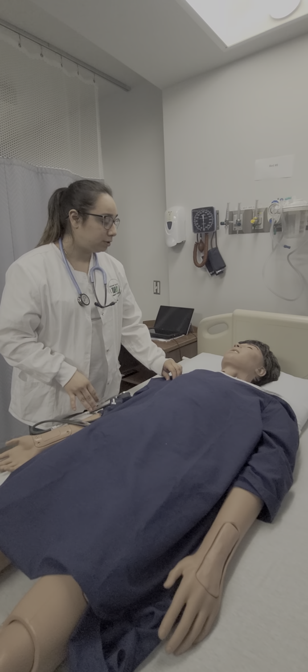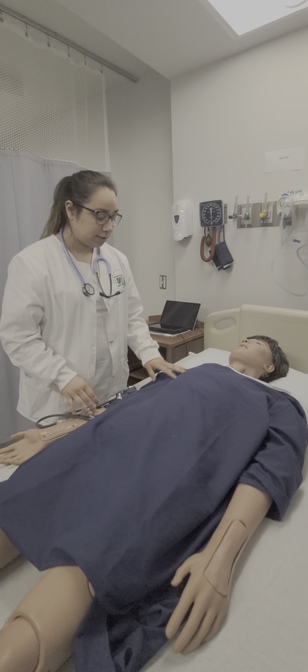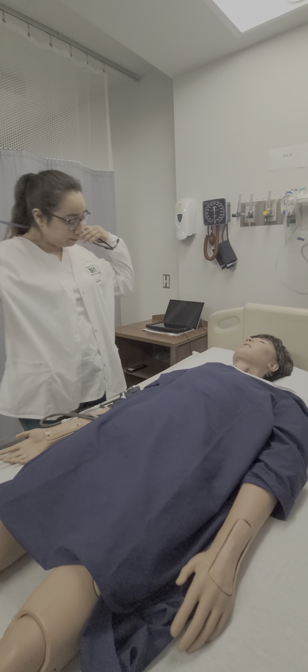Patient's respiratory rate, or breathing, is 16 breaths per minute. And patient's oxygen saturation is 98, which are both within normal limits. I'm now going to take your blood pressure.